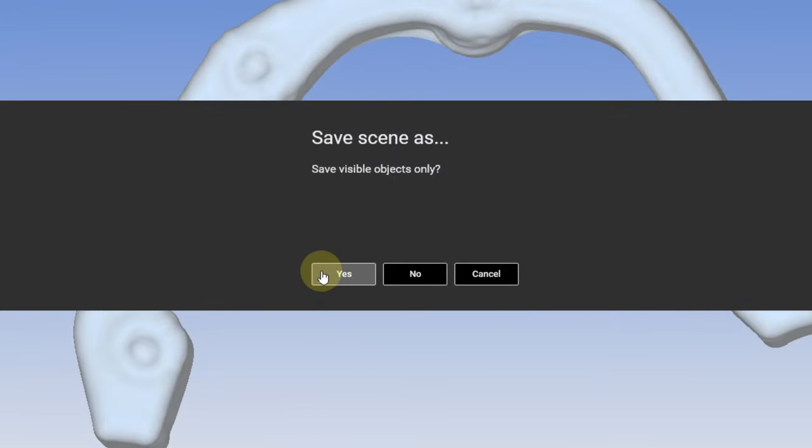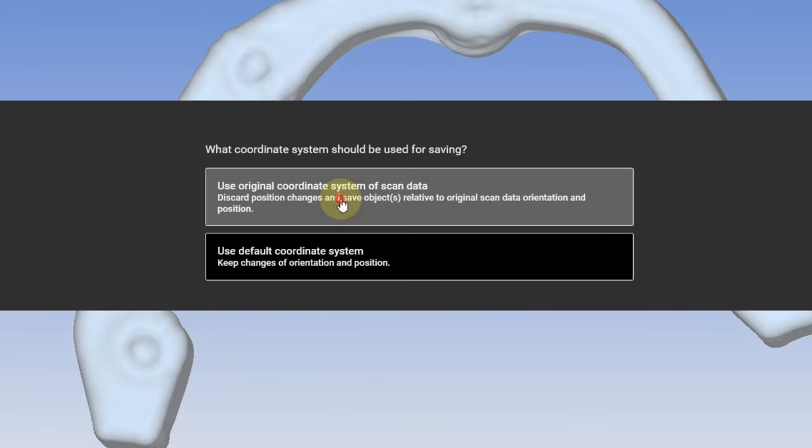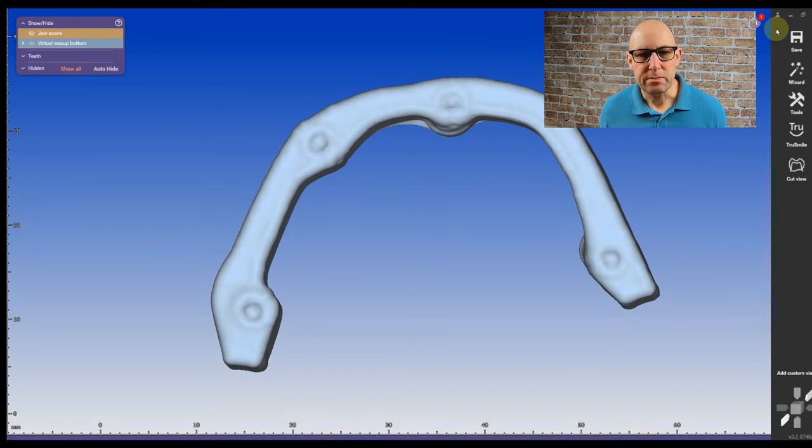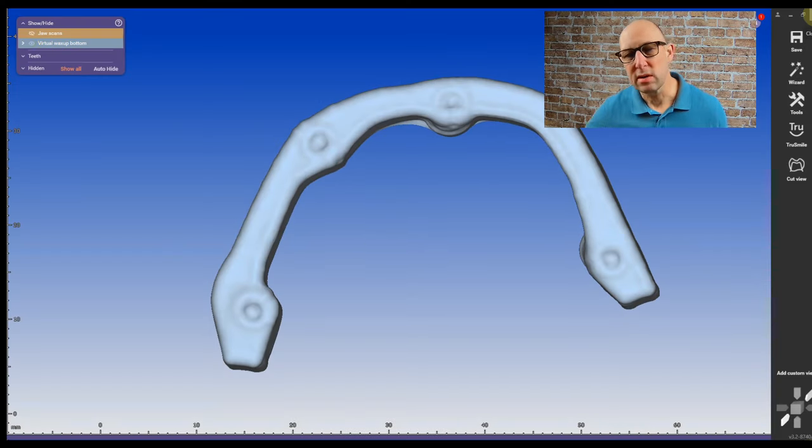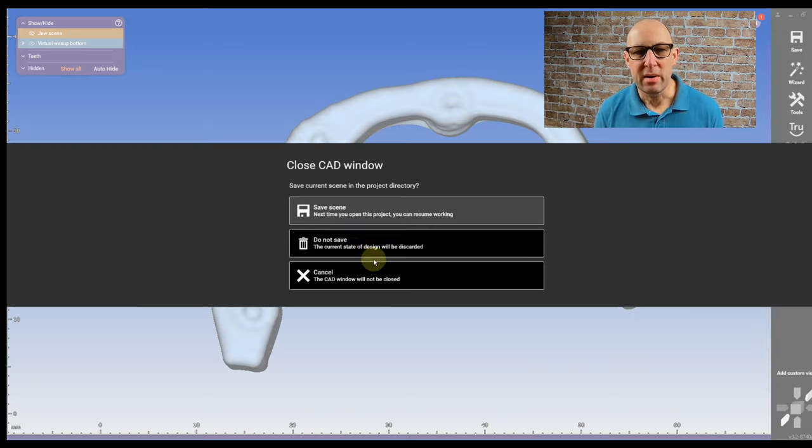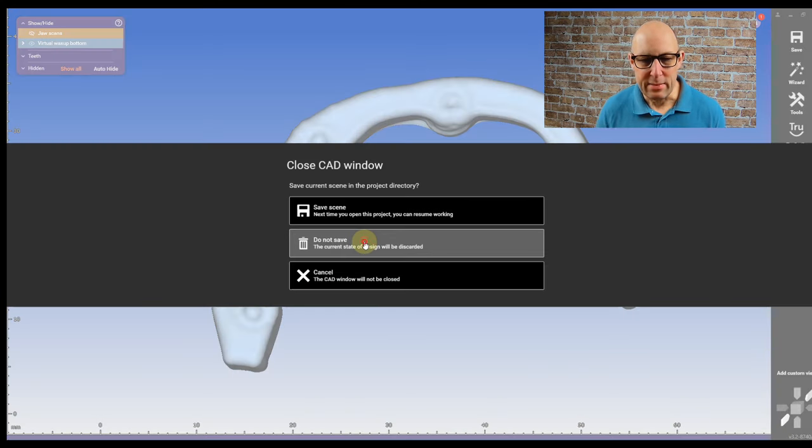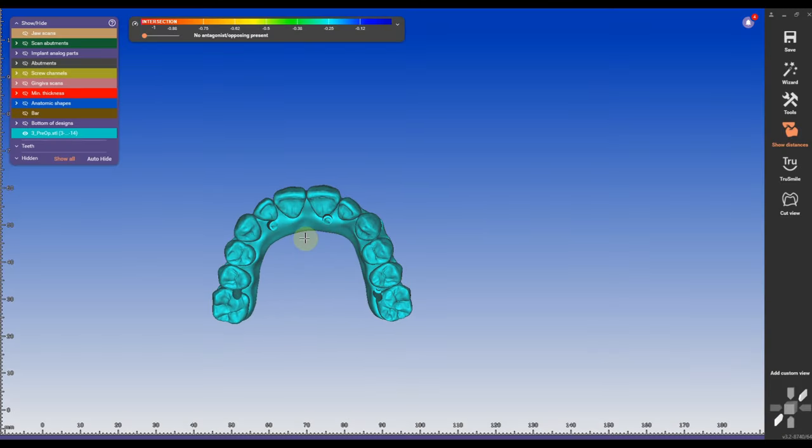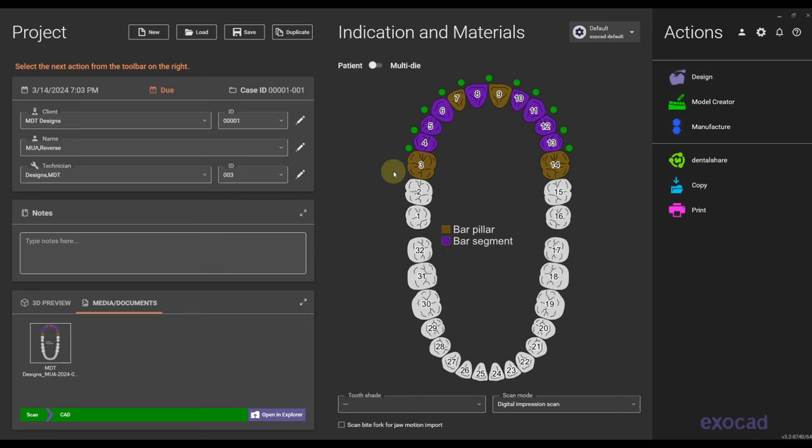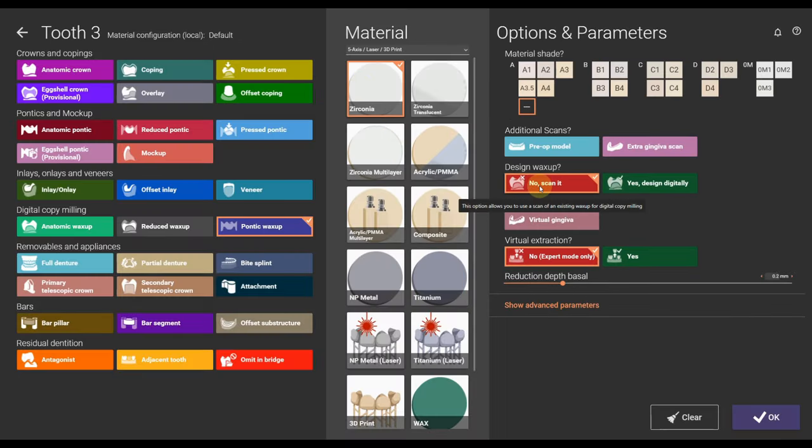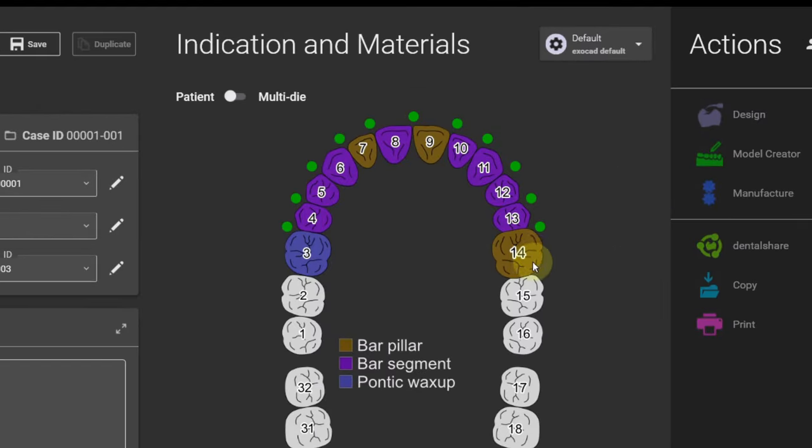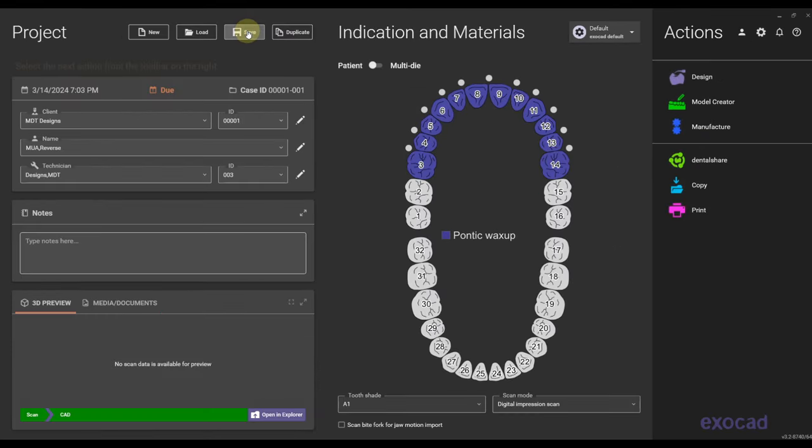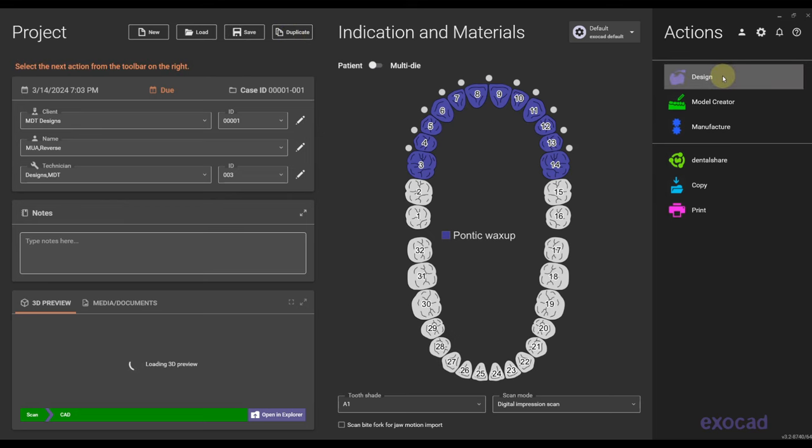Then I'm going to exit out. I don't need this anymore, I don't need this scene anymore so you don't have to save anything, you can keep it. Now I'm going to go into the same order form that I did before but I'm replacing all of this with pontic wax up. You can override it, you can create a new order form, completely up to you. I'm overriding it.